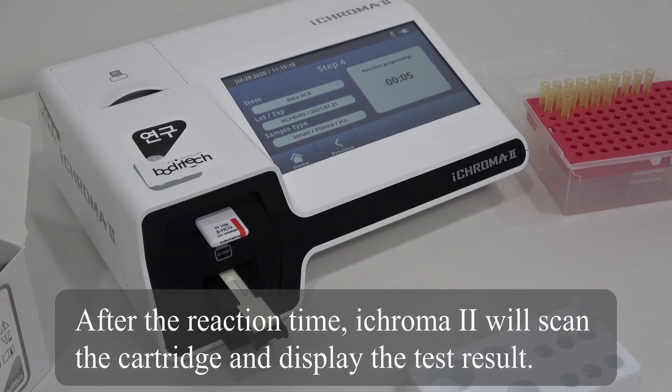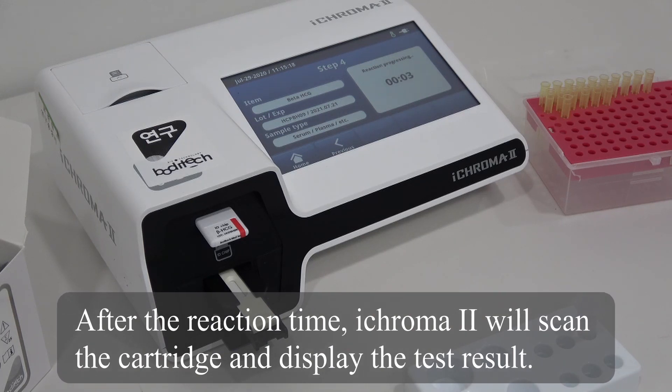After the reaction time, iChroma 2 will scan the cartridge and display the test result.